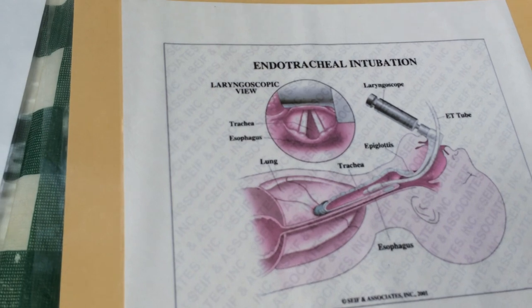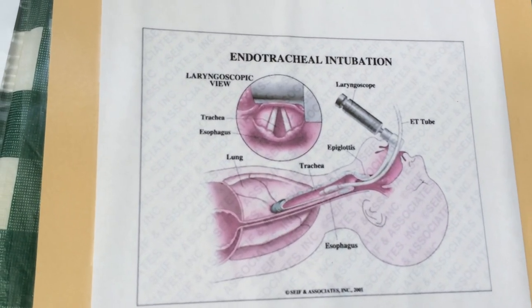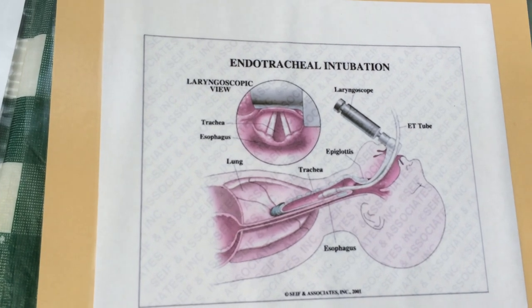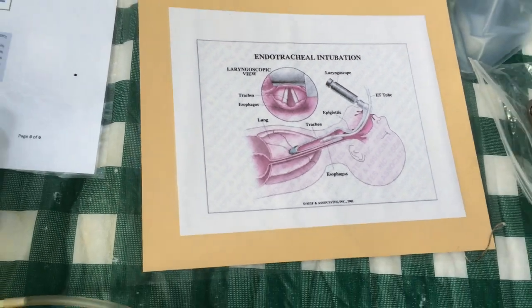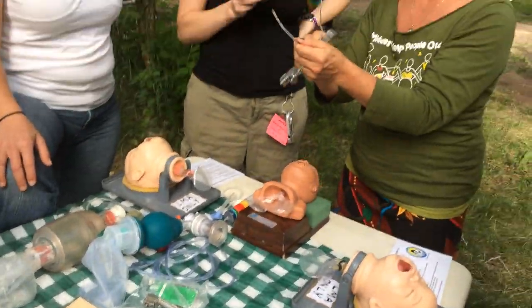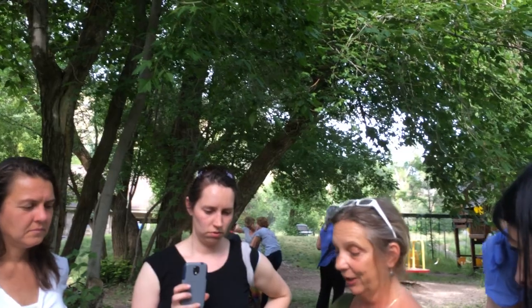If you want to see it. And then, the process again for doing this: you have to have a guide because this is really flexible and it won't go in without a guide. You have to have a tube this size that you think your baby is, and they are varied by how thick they are.